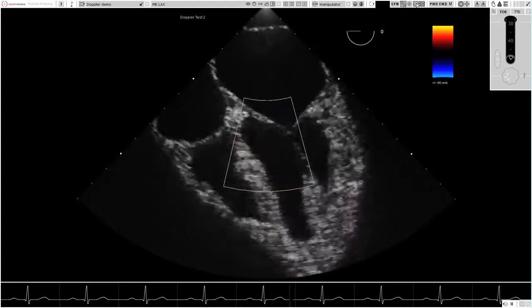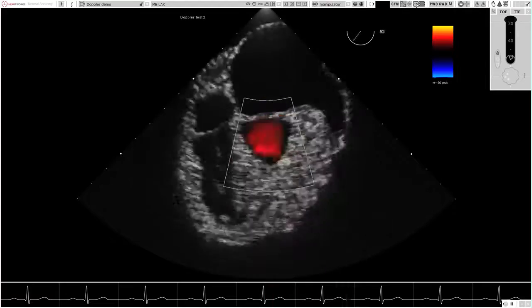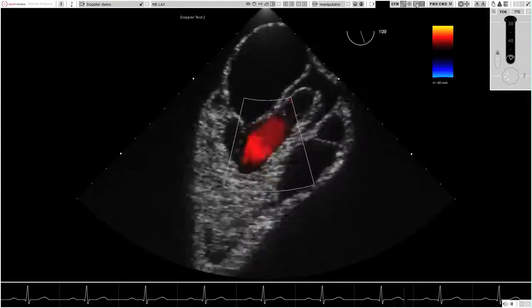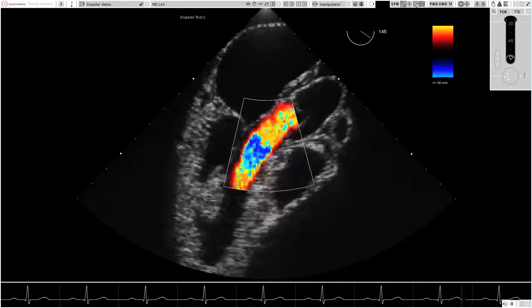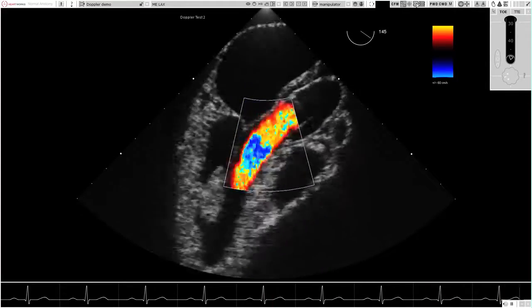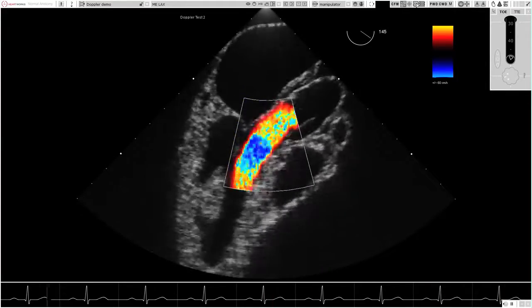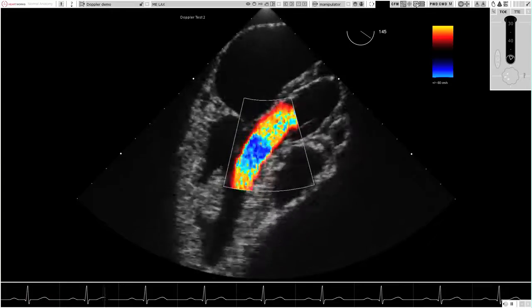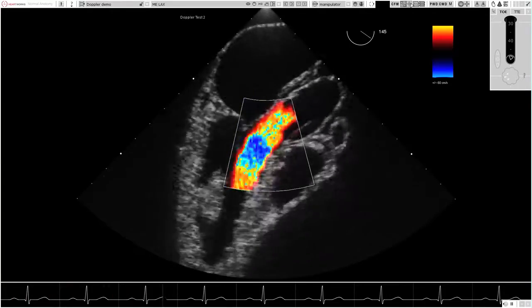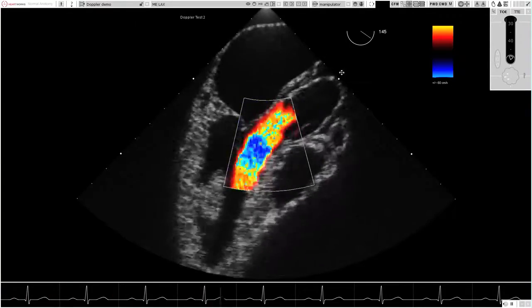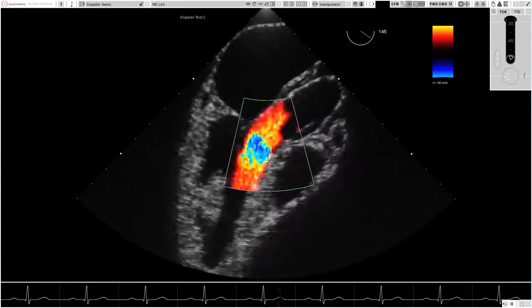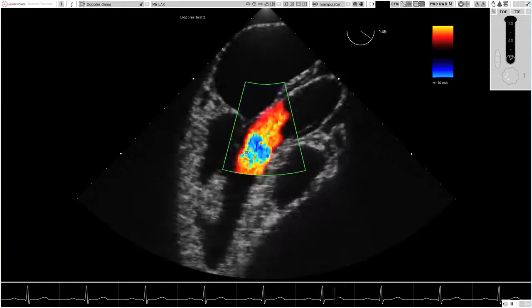The color display changes in real-time when the two-dimensional imaging plane is changed, with consistent accuracy. Aliasing is faithfully reproduced when the settings are appropriate.